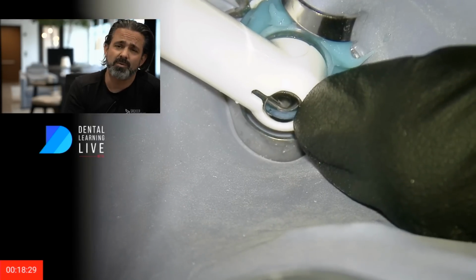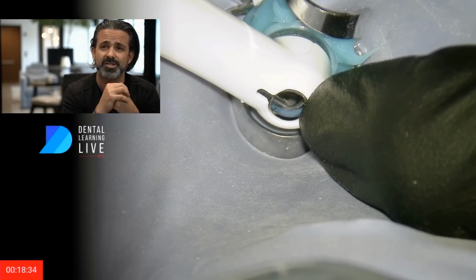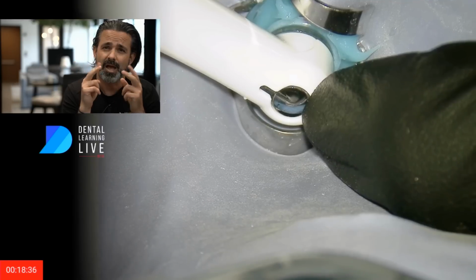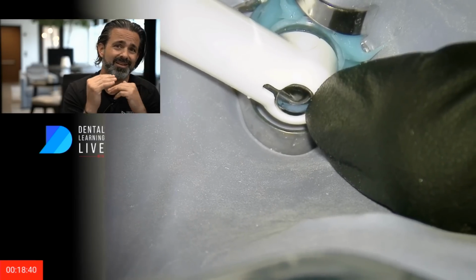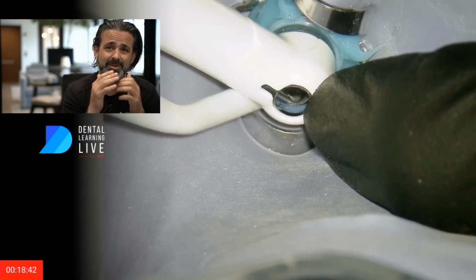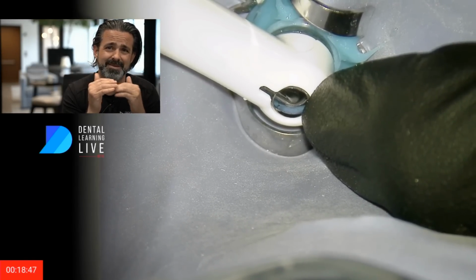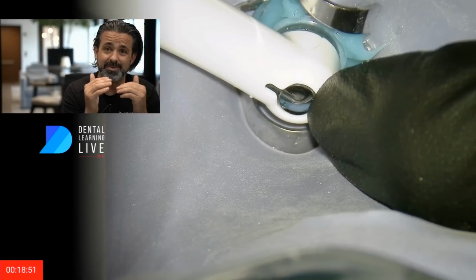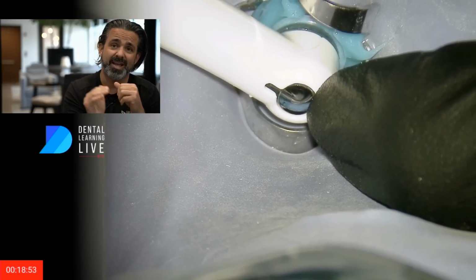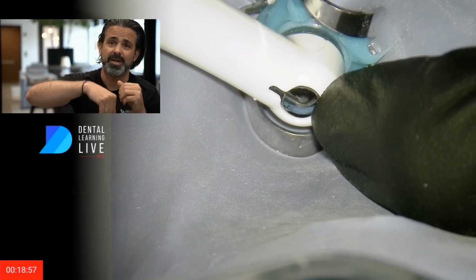And as I was in my passive step back zone, or my passive length termination from my measurement on my cone beam, I always measure twice and try to cut once. I was maybe three-quarters of the way down, maybe a little bit further, probably about 3 to 4, maybe 5 millimeters away from the apex. The reason for the maybes is the buckle. I felt like I could get down it, but the lingual was catching up, and I couldn't tell.